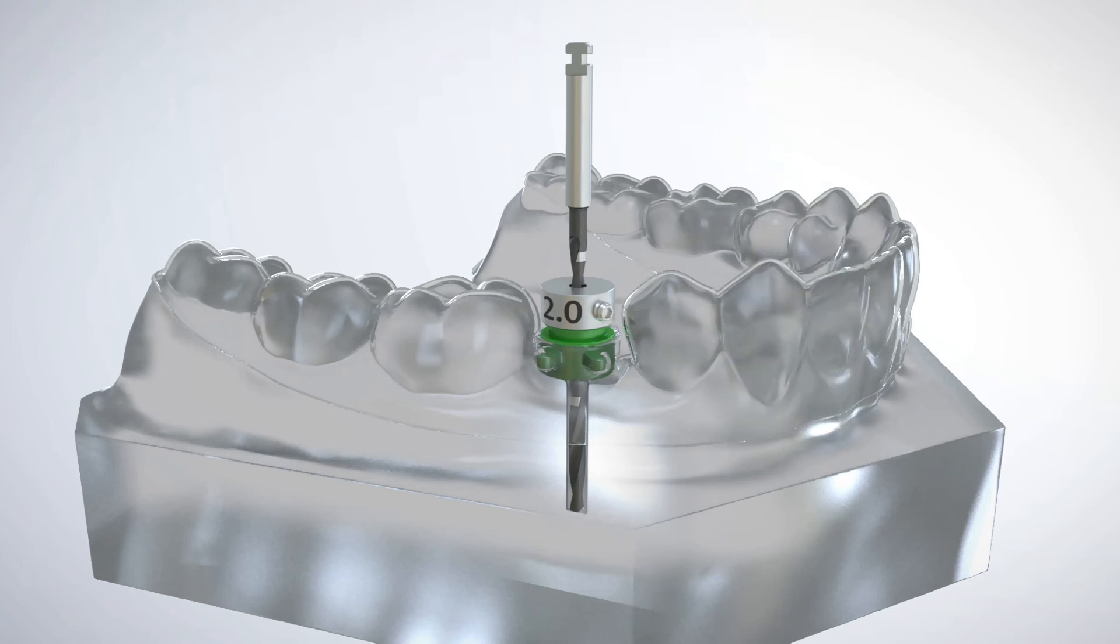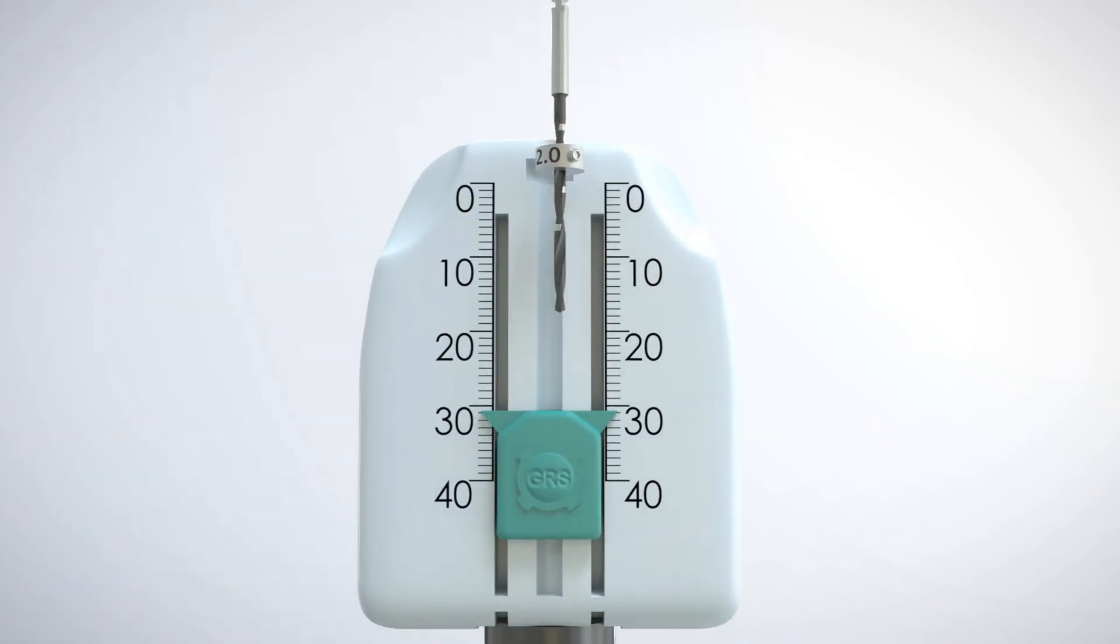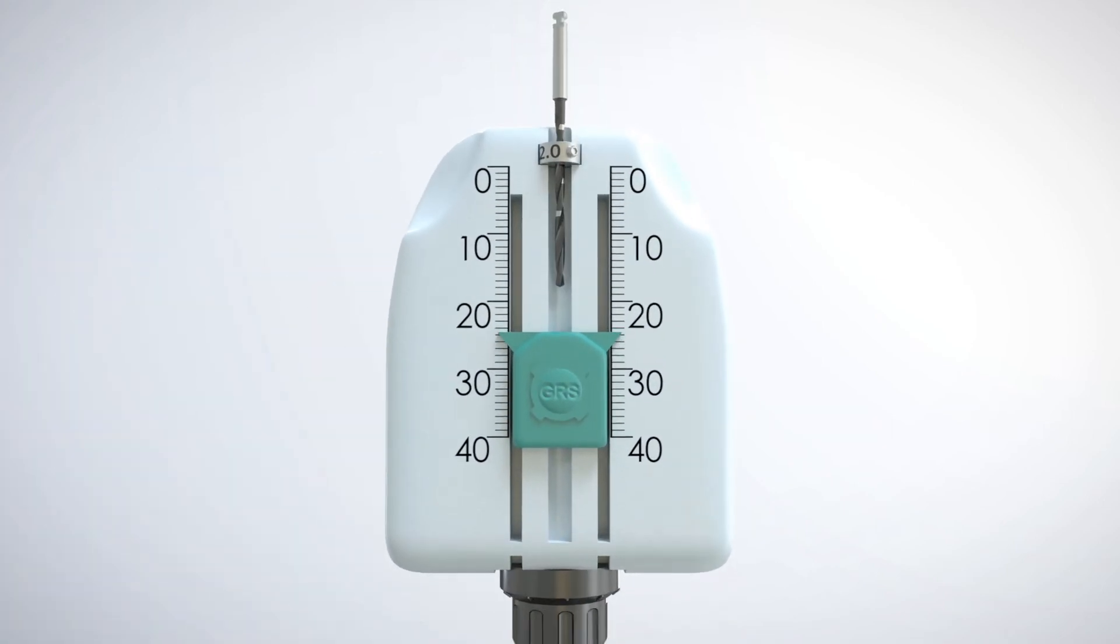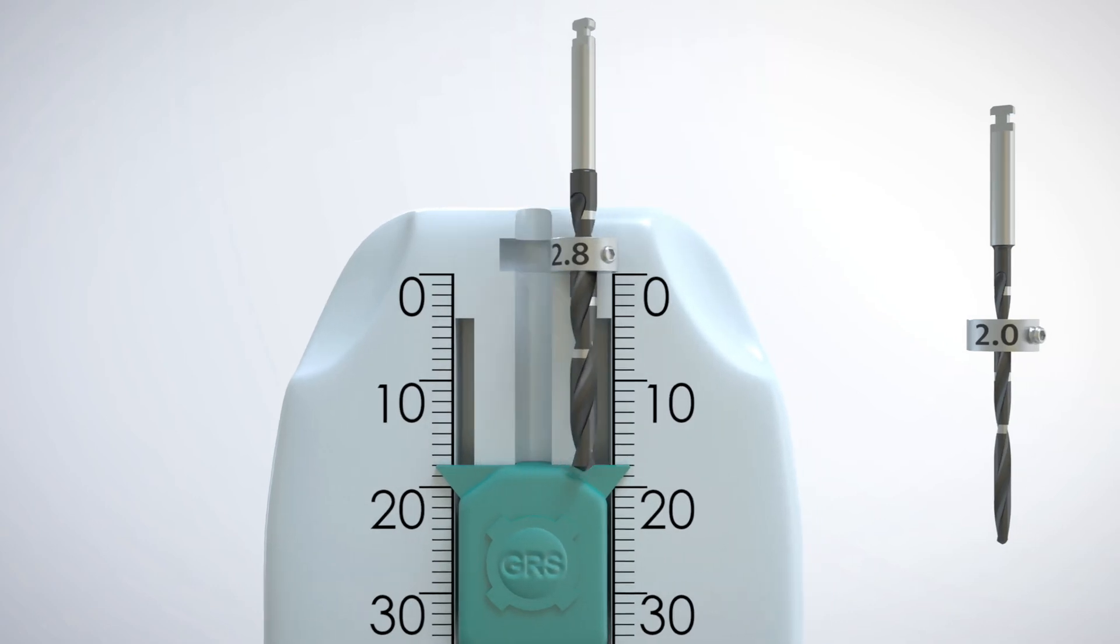The drill is placed into the GRS depth gauge which records the drill depth to an accuracy of 0.1 millimeter. All subsequent surgical drills can be set with drill stops at the same accurate position to ensure precise osteotomy depth.